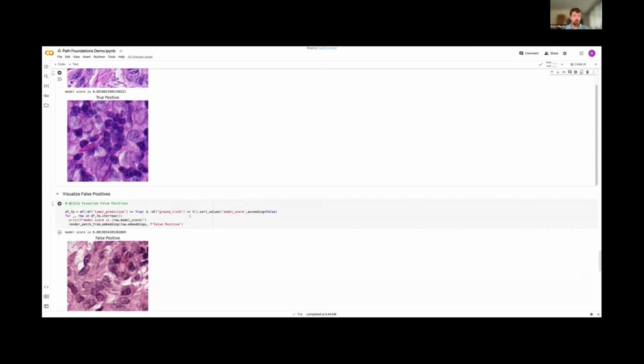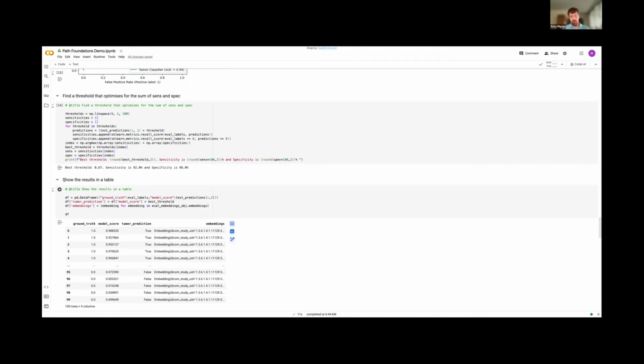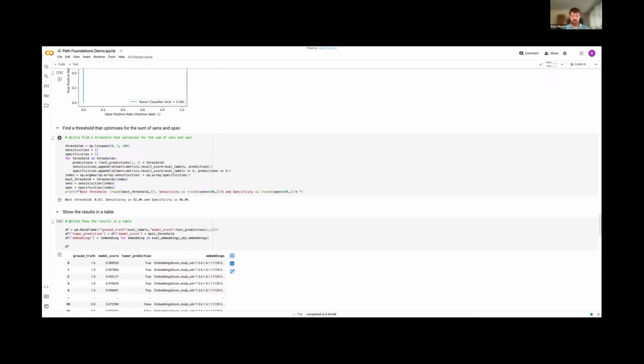Now, when it comes to using this to do more than just tumor, no tumor, it's important to understand, and I know I'm sort of pointing at code here, which is a little bit abstract sometimes, that the way we've done this is just an example, but you can collect 500 examples here, and you can label them totally differently. So we had 500 examples, 250 tumor, 250 no tumor. It learned that linear model that I mentioned before with the 384 parameters for that particular task.